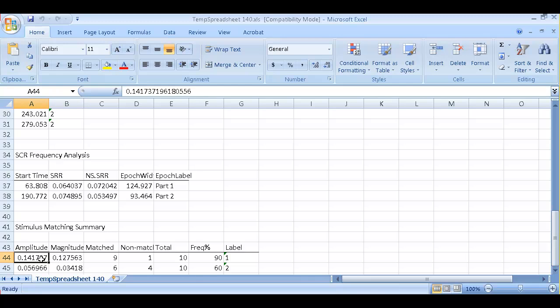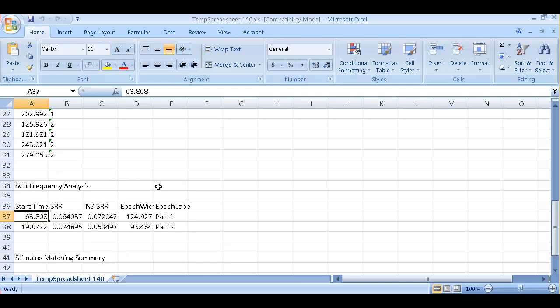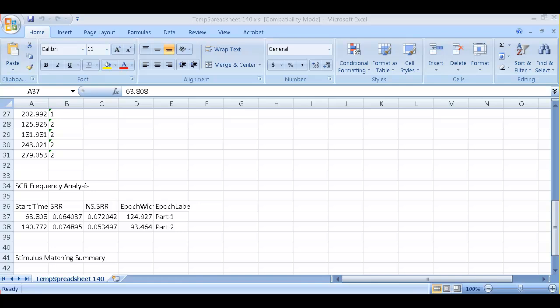The amplitude is the average of all specific skin conductance responses. The magnitude is calculated when we take all stimulus presentations and average the non-responses, which is zero, and the responses as well. We also have the frequency. This gives you a very good picture of the type of responses we got to these events. As we can see, we got more responses to the scary events, and the amplitude and magnitude were both higher. This table provides information for the rates of specific and non-specific skin conductance responses in the two different conditions of the experiment. A detailed description of this analysis is included in the software manual.